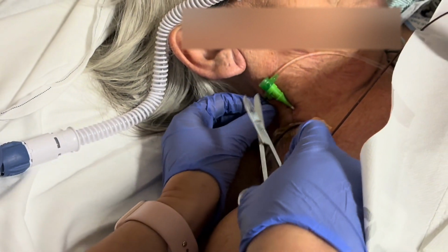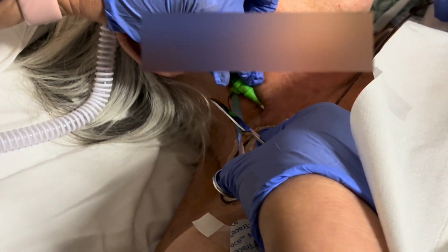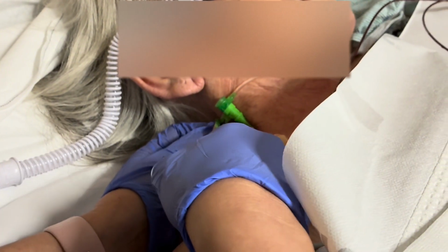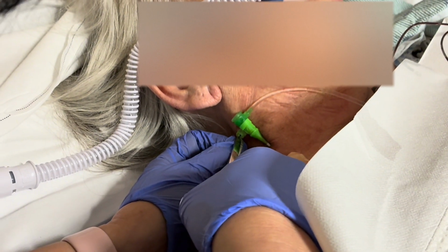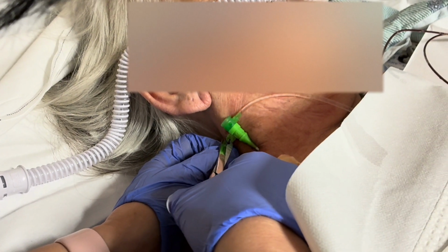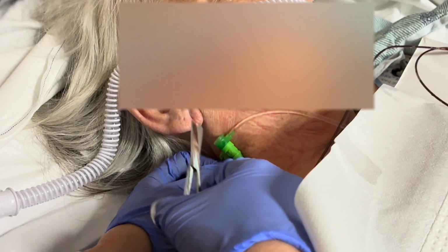When you take this out, it's always the same thing with central lines and your PA catheters. You want to make sure that the patient is actually lying flat because you don't want any embolism, right? We all know that. Take this out, if I could take it out, of course. This is very tight.